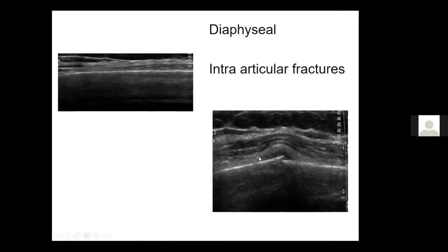Here's an example of a diaphyseal fracture of the rib. You can see the cortex very clearly here — it's a white line, highly reflective. Ultrasound is reflected by bone because it contains calcium, and there's no image beyond it.